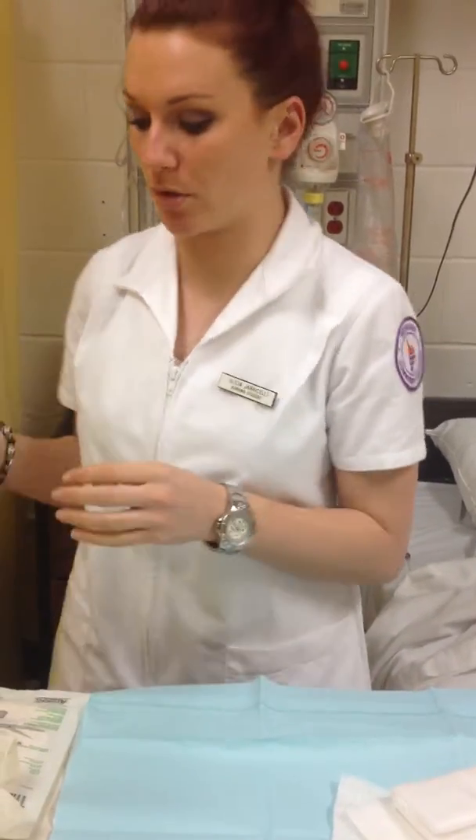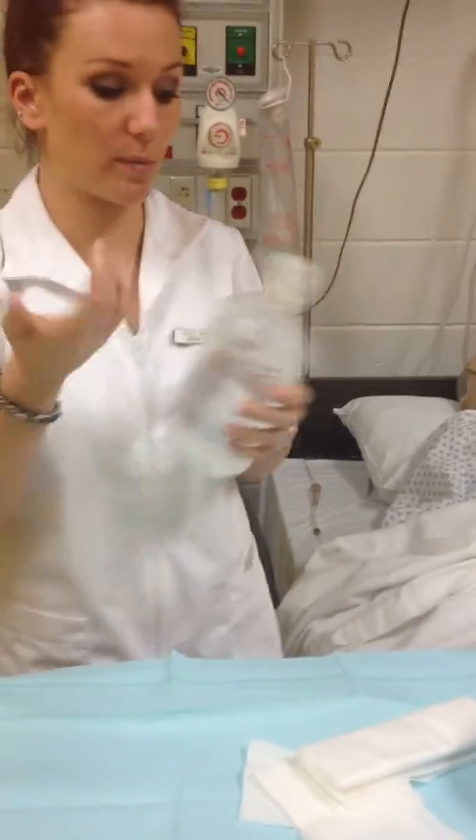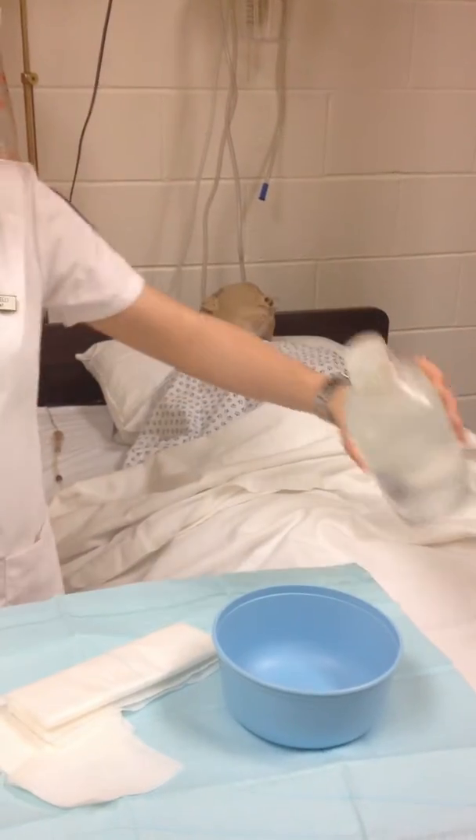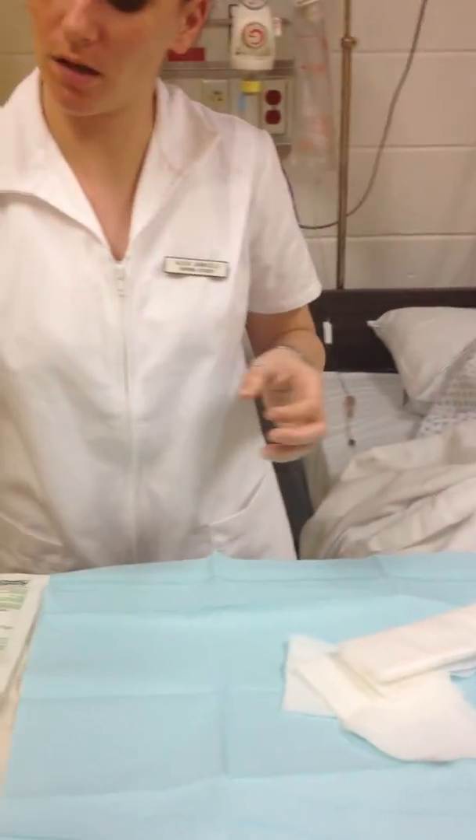Had this been opened already, we would pour a little bit out into the waste basket, and then we'd be able to pour it in. So because it's new, I'm going to open it, I'm going to be able to pour a little bit in, recap it, and put it down.